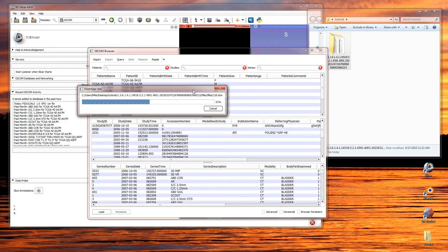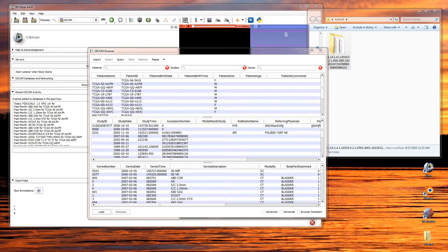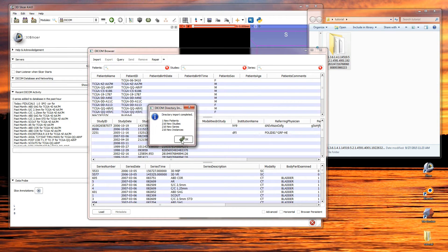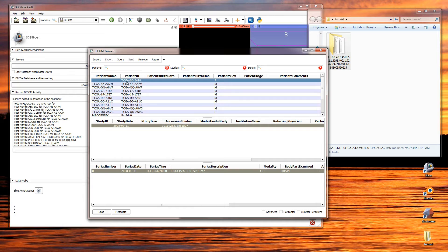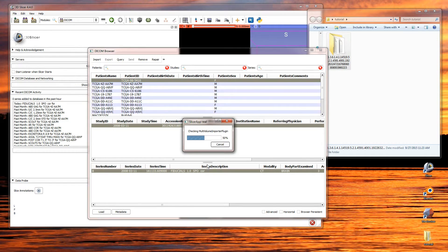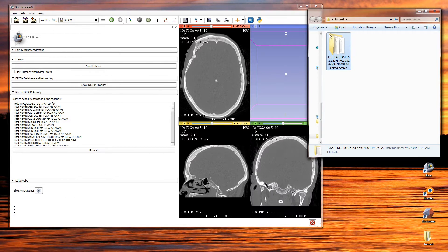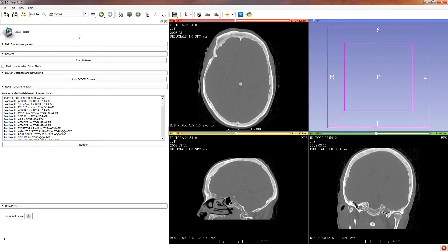Slicer is a great software program used for a lot of medical imaging research, and it's wonderful that the Slicer team has made it freely available for download — it is open source. Once our DICOM image set is loaded, select the study TCGA065410, that's our skull file, and click on the load button.